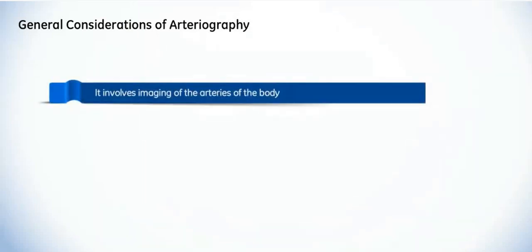Let's begin the module with an overview of arteriography. Arteriography is an imaging technique employed to visualize the arteries in the body. Most often, visualization of the arteries involves the injection of contrast agents into the blood vessels.